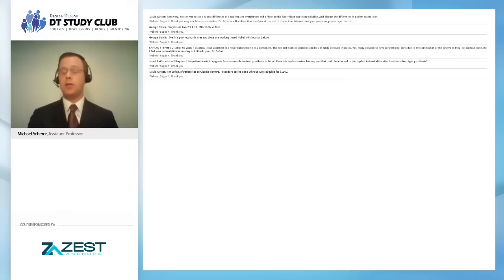And it's, again, beyond the scope of this clinical presentation to talk about the indications of when we flap versus flapless. But the number one reason why we would need to flap is if we do or do not have enough prosthetic space.